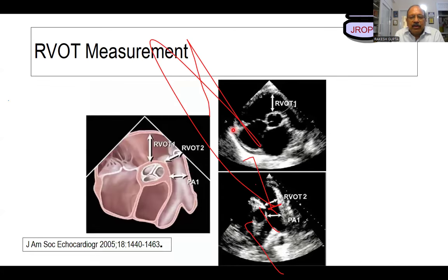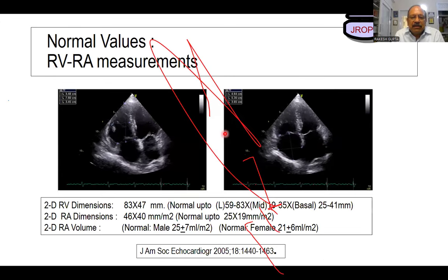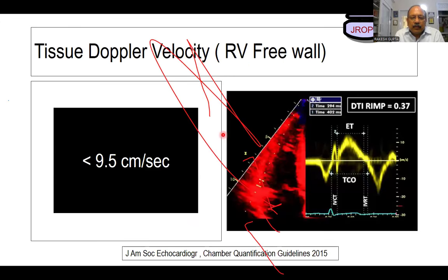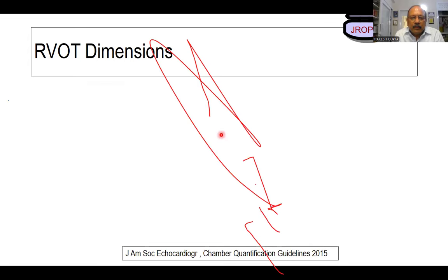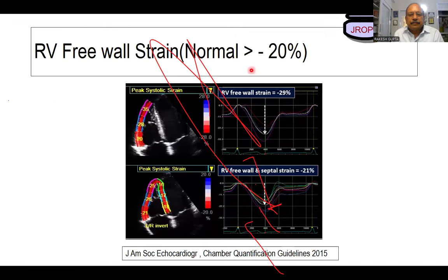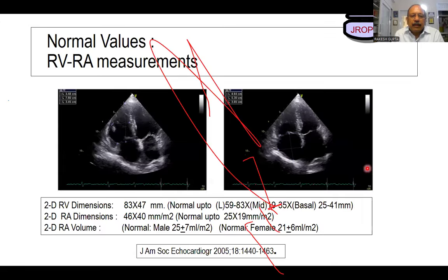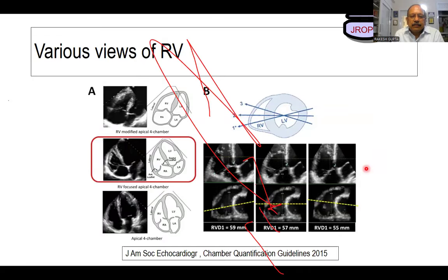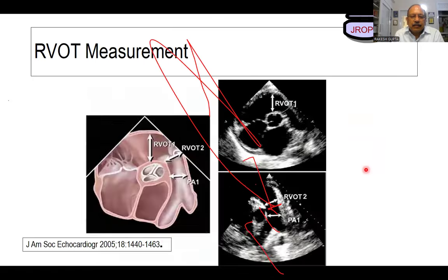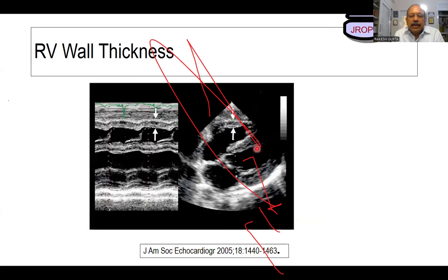Hopefully I will show where the RV free wall is if my picture shows live.